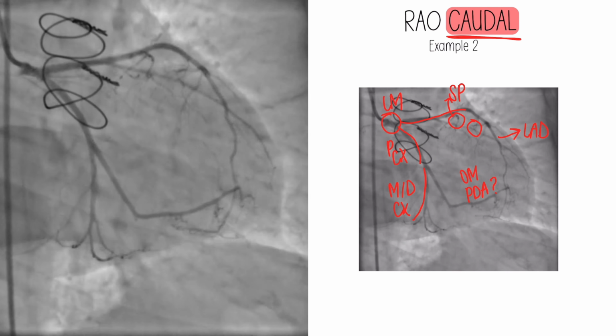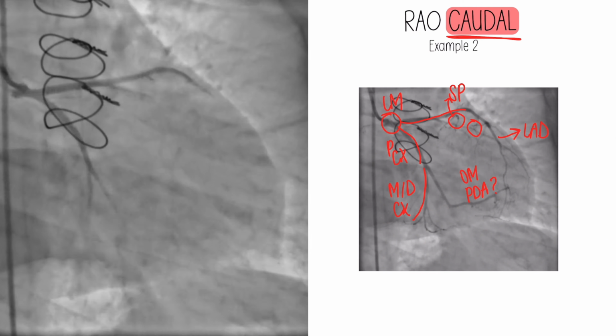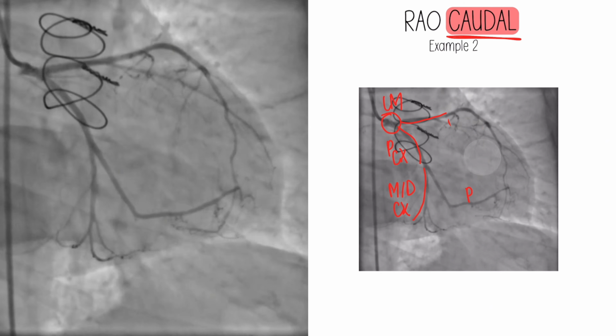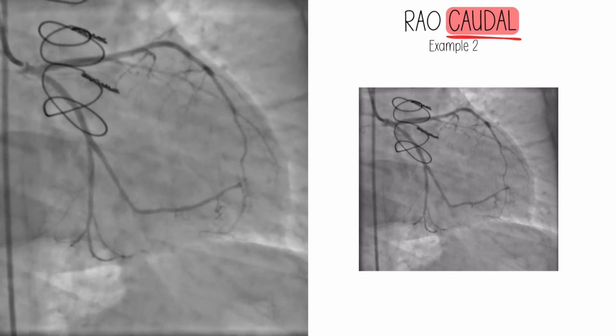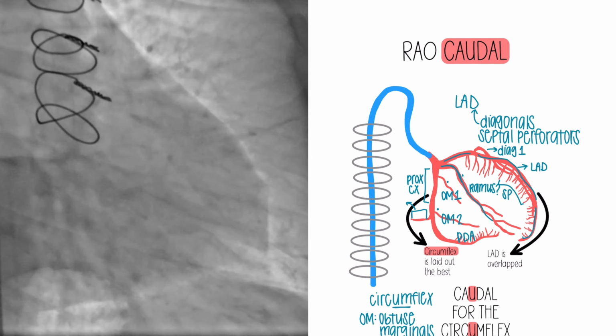So you do the best you can with the information that you have at the moment. And the more diseased your patient gets, the harder it's going to be. But what you can do, let's go back an example or two here, and I'll bring this one over.